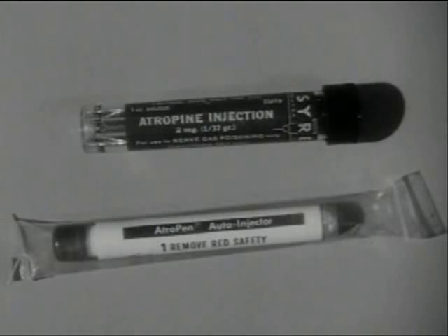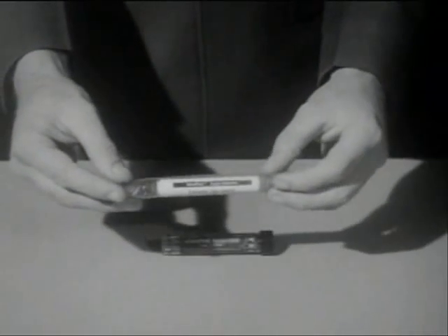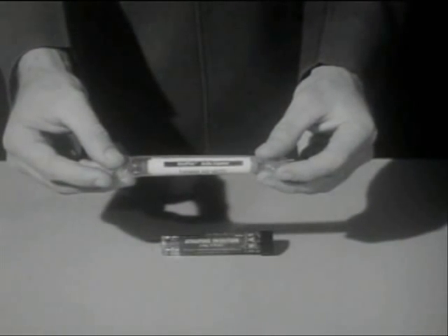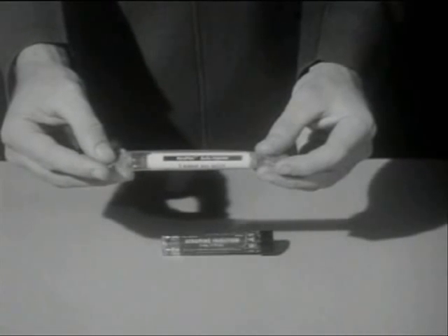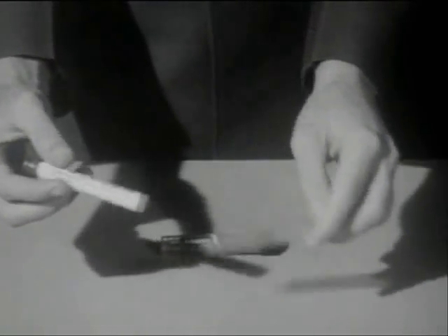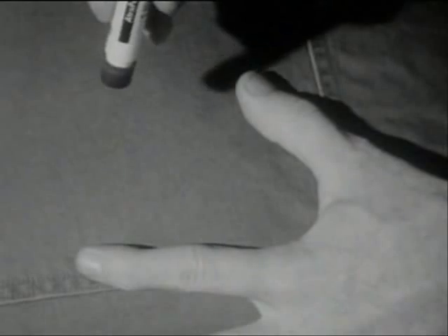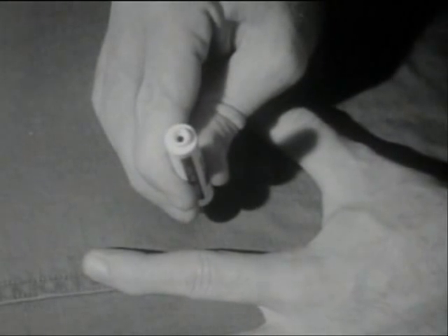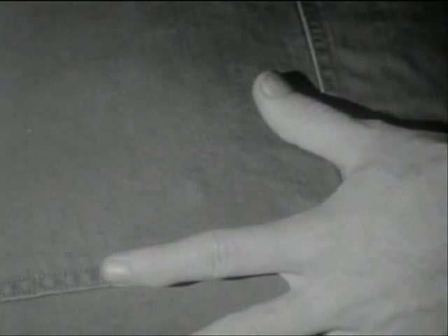There are two types of atropine injectors, and you should be familiar with both of them. One is the auto-injector: a hard plastic tube containing atropine and an injection needle triggered by a coiled spring. You remove the wrapper, pull off the red safety cap, and press the blue end of the tube hard against the muscle until the needle releases the fluid into the body. For self-injection, the thigh muscles are the easiest to reach.